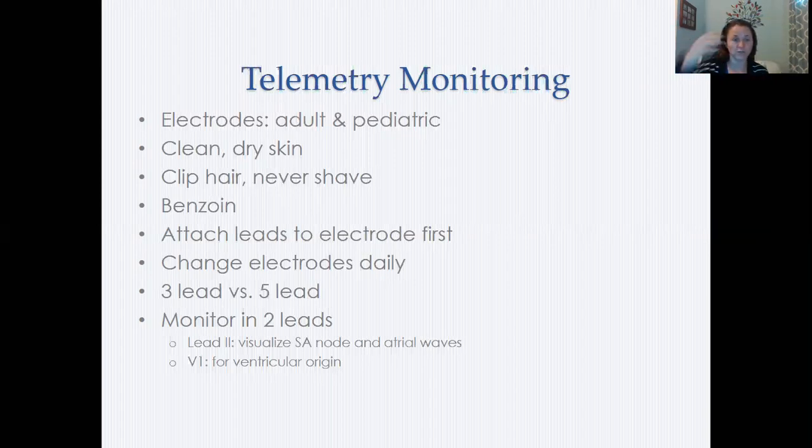They're taking pictures from a different angle. So you're going to see that electricity pathway coming in from a different direction. The more camera views you have, the more accurate the picture is, right? So a 3-lead is going to have fewer views of the heart than a 5-lead, and that's going to have fewer than a 12-lead. So we'll talk more about 12 leads coming up.